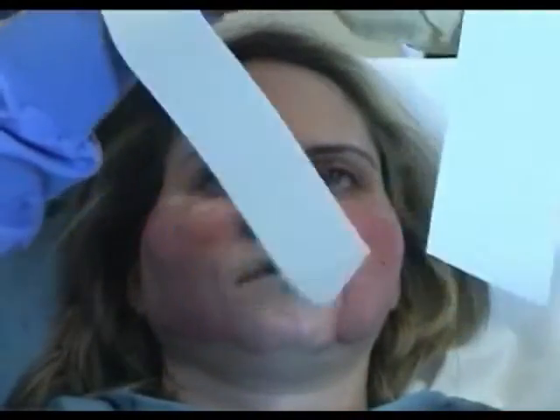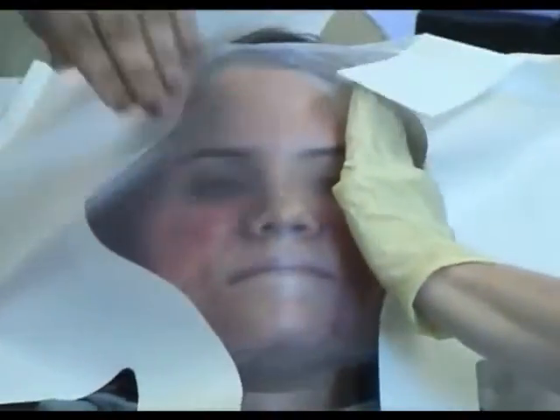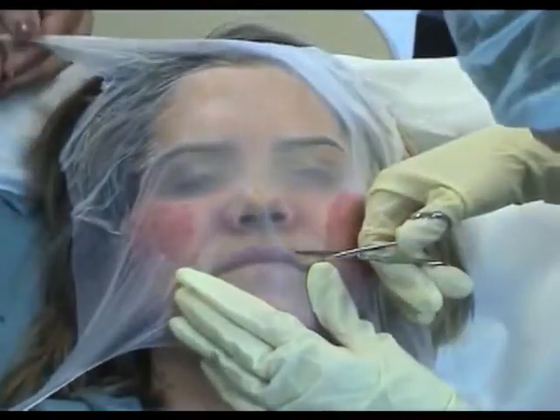Following the procedure, an occlusive dressing is applied. Here, a Cylon dressing is being applied over the resurfaced area. The Cylon dressing is stretched over the area, and then incisions are quickly made over the nose, mouth, and eye areas.